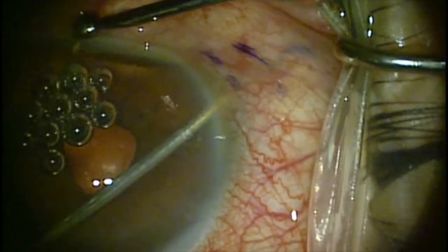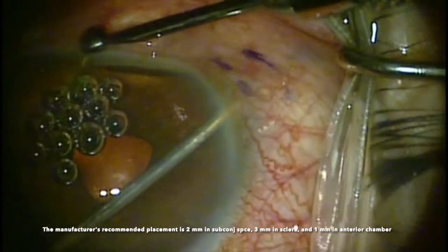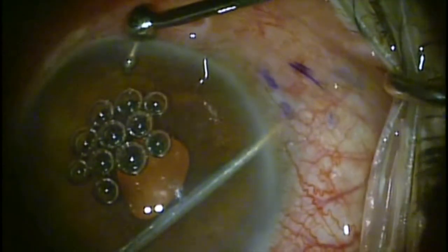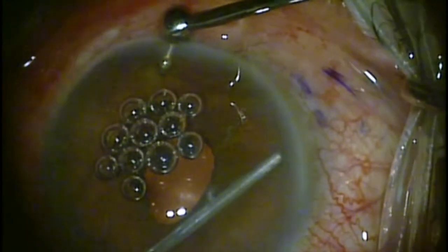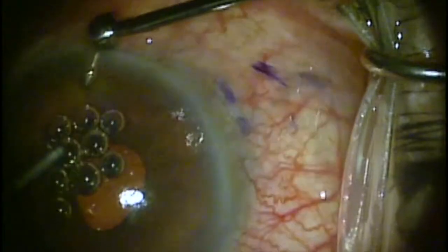Remember that advancing the Zen between the first and second clicks actually retracts the needle. So it's very important that as you're retracting the needle, there's not a lot of pressure on the eye. You should totally relax pressure on the eye as you approach that second click before pulling back, or the tension could flick the Zen stent and dislodge it from the sclera.